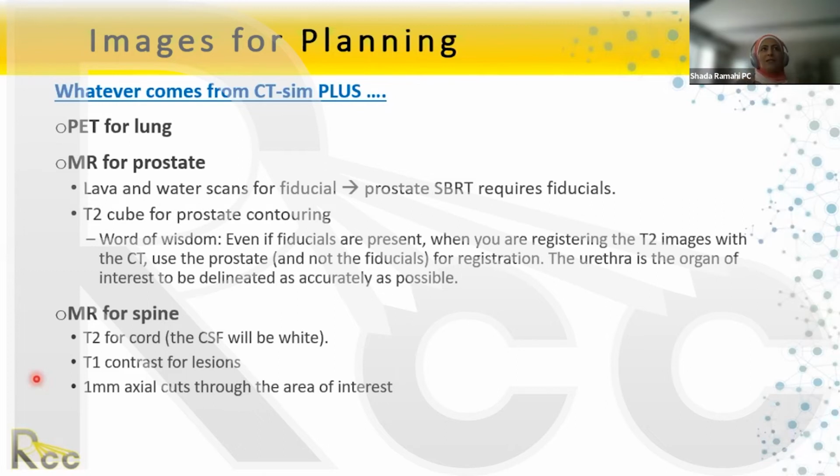I have seen at most 2 vertebrae being treated for SBRT. I haven't seen more than 2 vertebrae. We can ask Ben and Light if they've treated more than 2 vertebrae for SBRT, but in the practice where I worked, 2 vertebrae were the most. So we just concentrate the registration on those 2 vertebrae, regardless of how the spine curves above or below this region of interest.